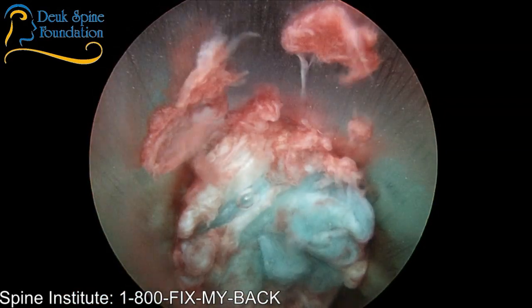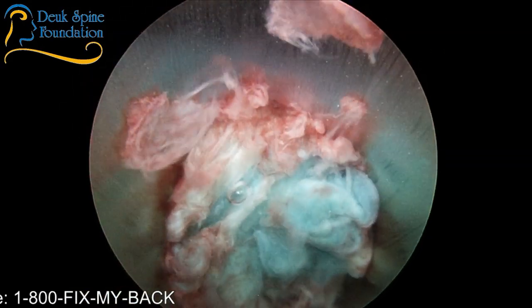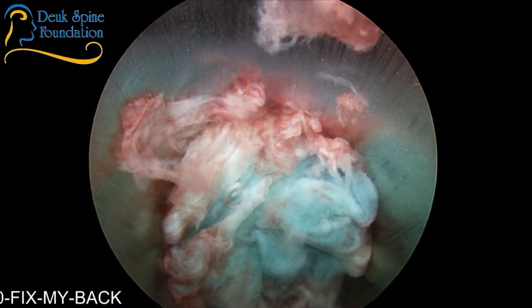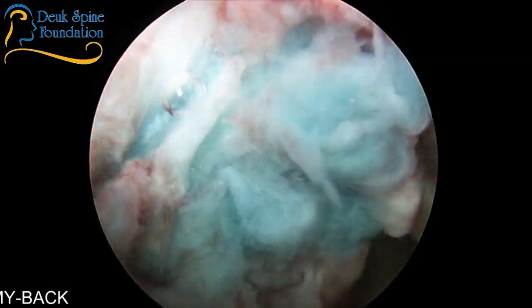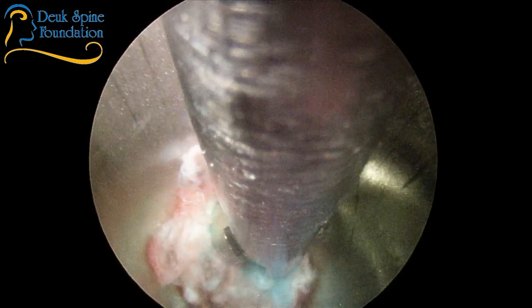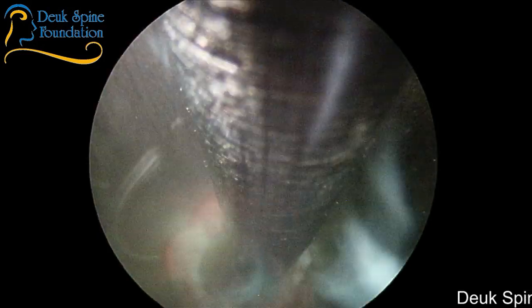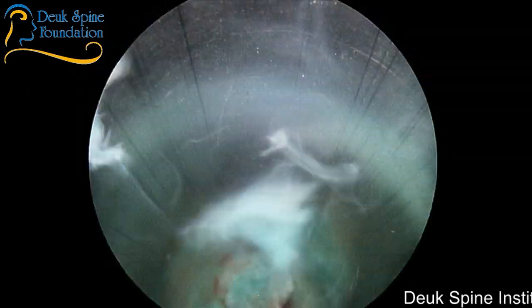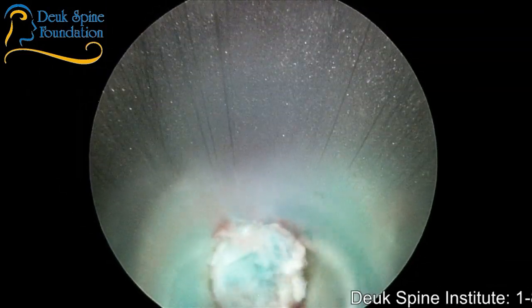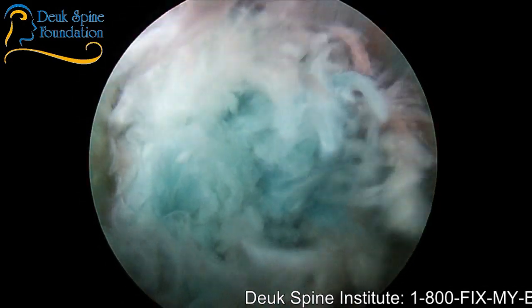Beautiful. So we're inside the disc, and what you're looking at right there, folks, that blue thing is the herniation. To me, that looks like a softer herniation. It's not as scarred up. This is the worst level. We know L45 is the worst level based on the MRI. He has a really big herniation here, which I think I've shoved into the disc pretty good.